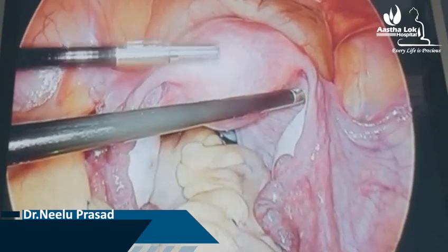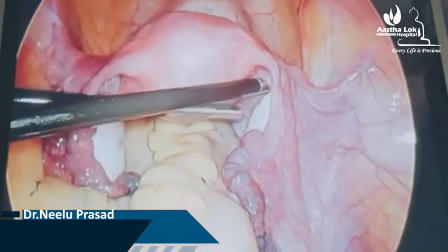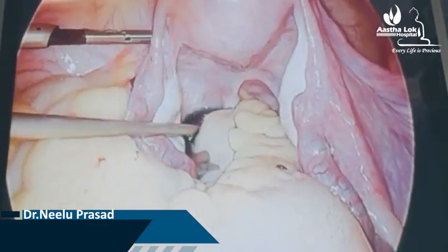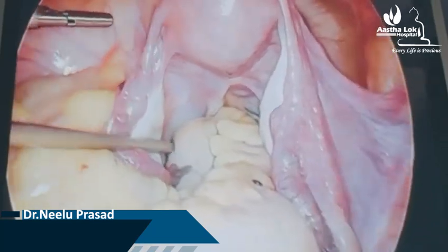So both the tubes are normal and functioning. So fertility can be natural, or might be due to some other reason, might need IVF and another ART procedure.